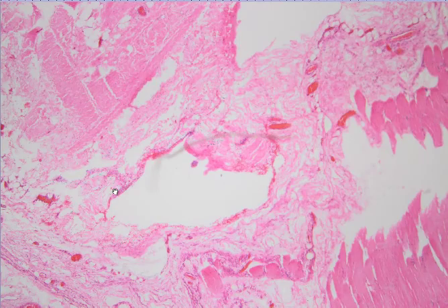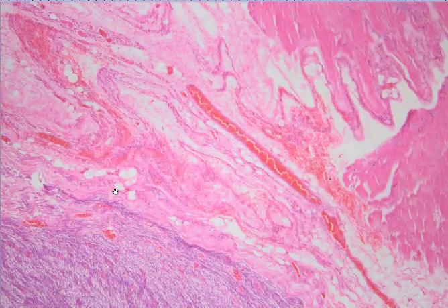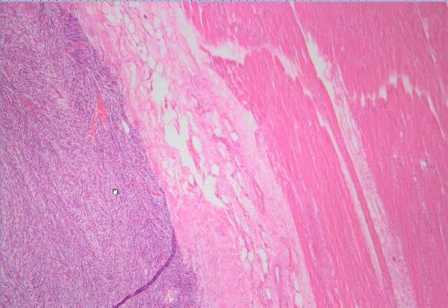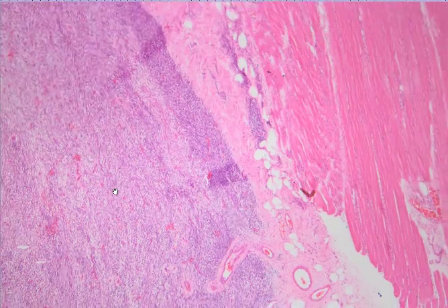And this is a younger patient, 15 years of age, and this is synovial sarcoma. As you see, the borders are more well delineated. You may have some finger-like protrusions, but they are not infiltrative, they are just pushing borders.